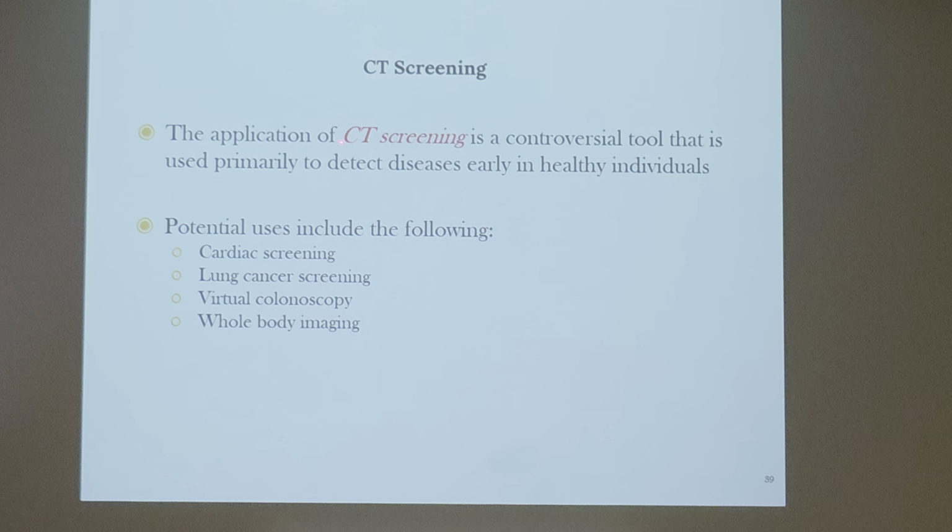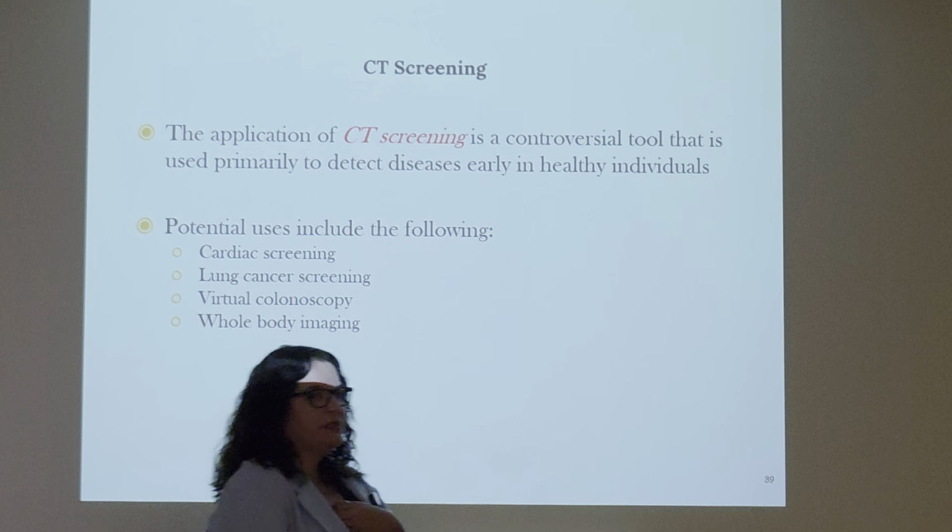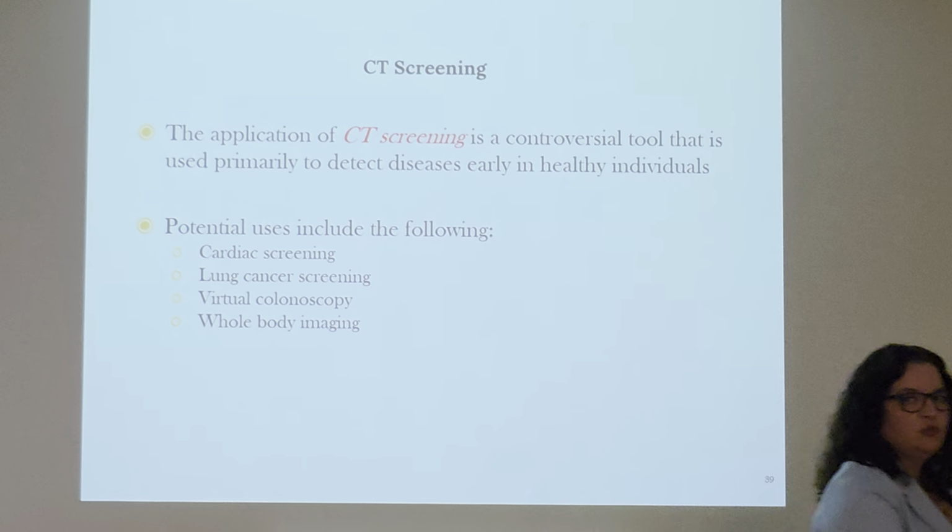The application of CT screening. Screening is a controversial tool that is used primarily to detect diseases. What did I just say that we needed to produce in our images in order for the radiologist to do what they needed to do?